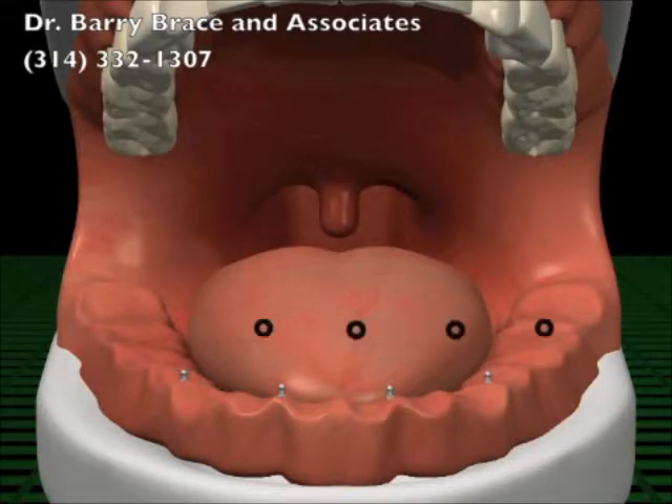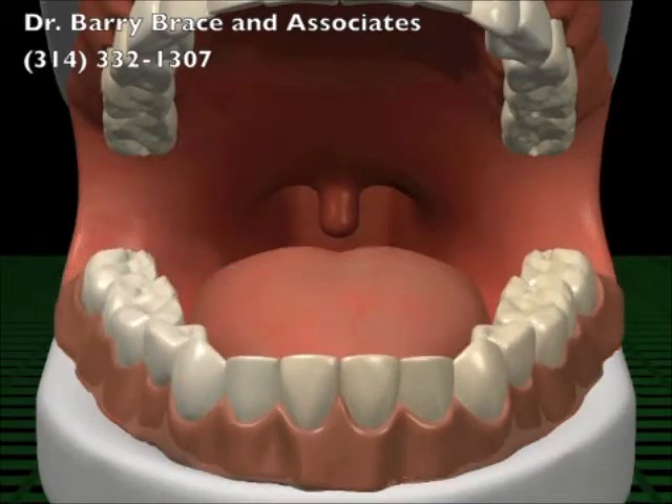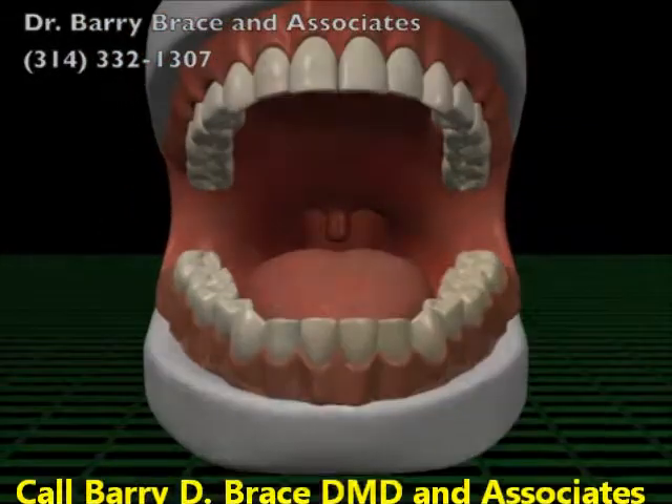Your denture snaps securely onto the head of the implant. Often, your existing dentures can be used. The end result is a comfortable denture, without the need for messy adhesives.